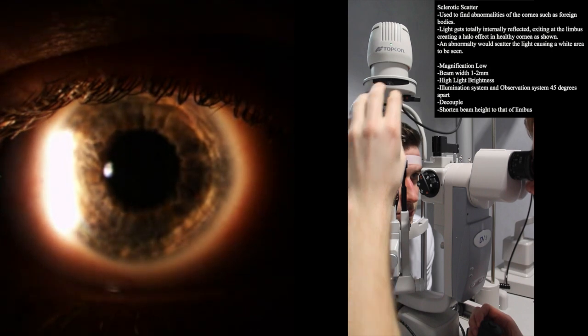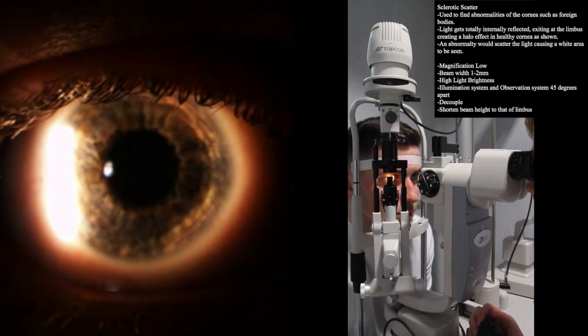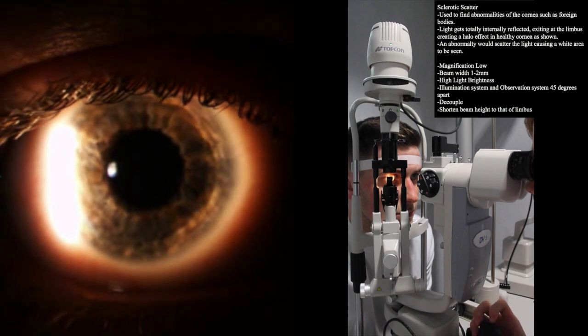The light is totally internally reflected in a healthy cornea and exits at the limbus, creating a halo effect which can be seen here.